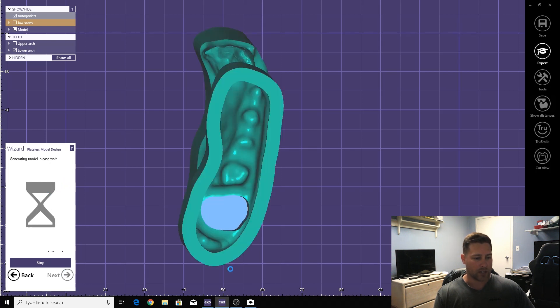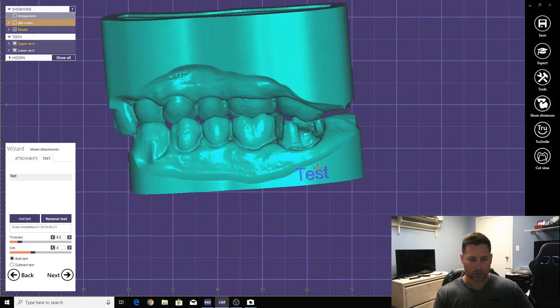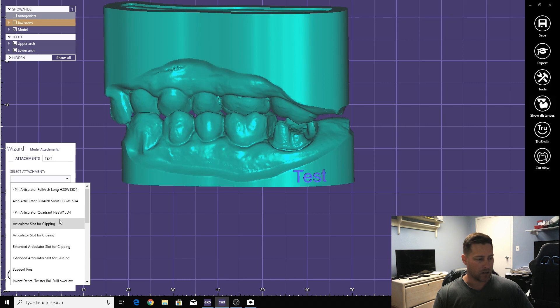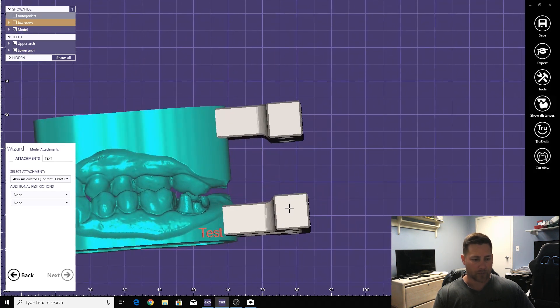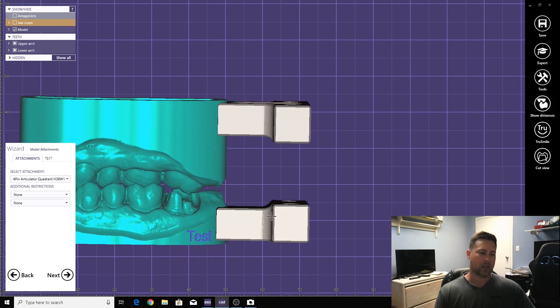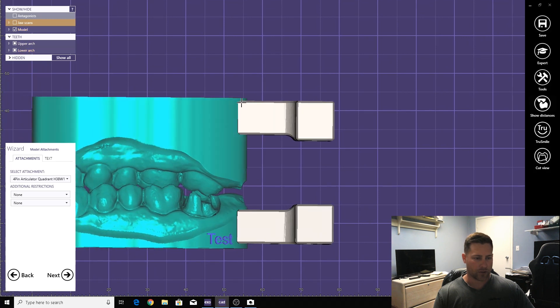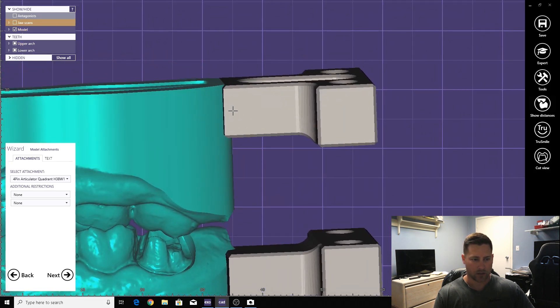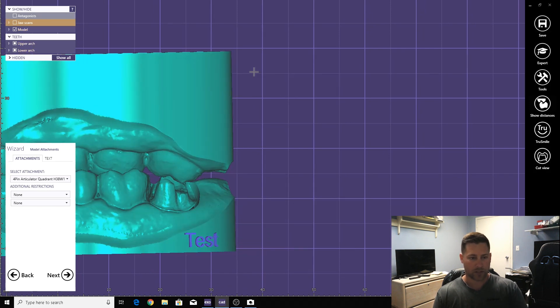Here you can add the patient's name onto the model. Come to Text, type in the patient's name, hit Add, then click where you want it. If it's red it's not adapted well, so make sure it's blue, then hit Next and you're finished. If you want to add an articulator, click on Attachments, select your attachment — I believe this is the iTero one — and get it lined up properly. You need to change the spacing to 38 millimeters because that's how far apart this articulator is, otherwise it'll have issues printing. You want it flat across, with 38 millimeters between the two models. To delete it, just hit the Delete key.